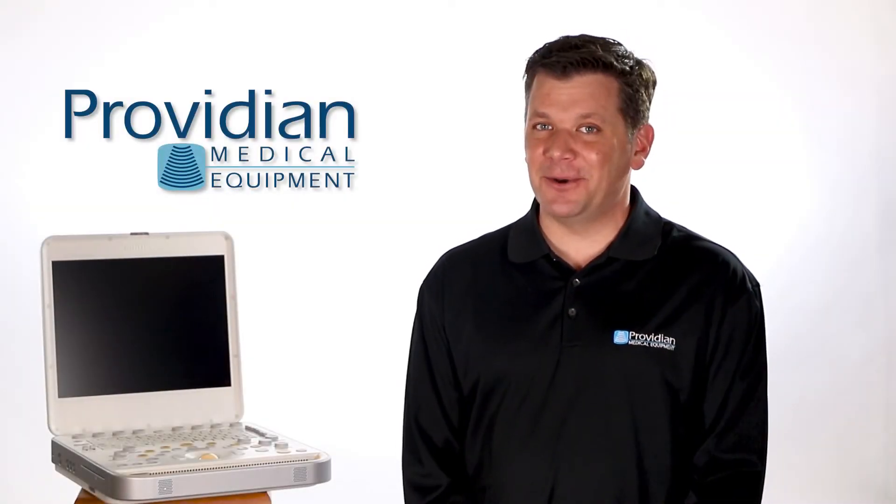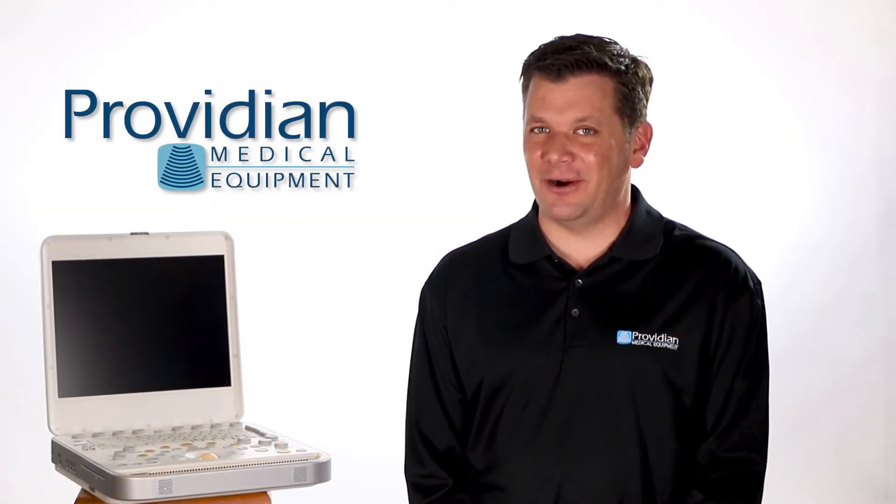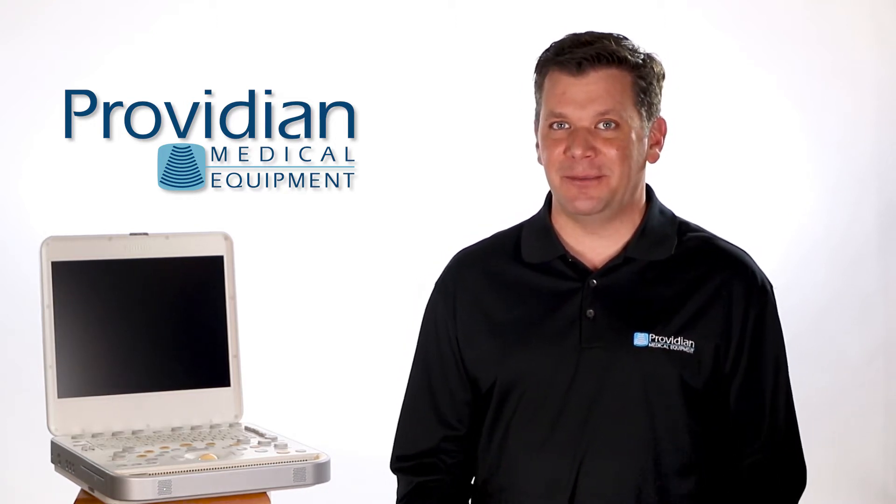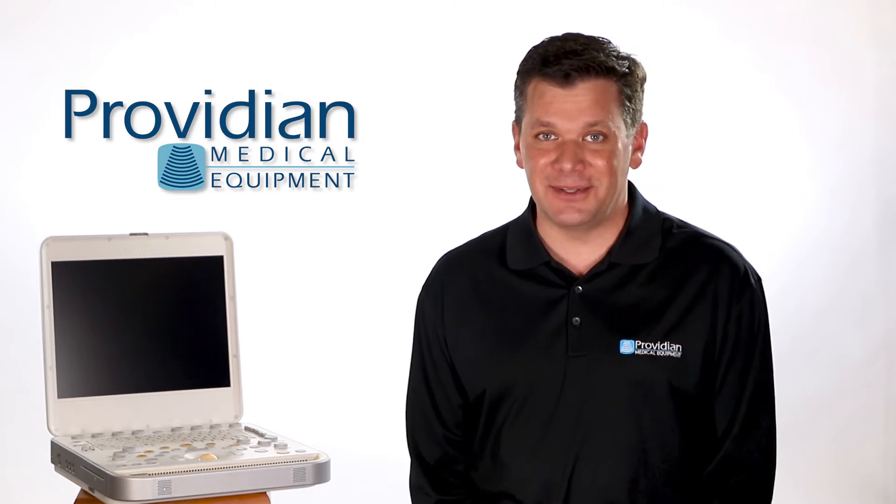The Philips CX50 has long been known as the gold standard in portable cardiovascular ultrasound machines, but with a new set of lower cost machines getting closer in image quality, is the CX50 still the top dog?